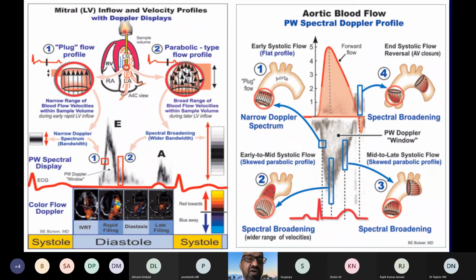So they are all close to the mid-clavicular line. At the apex, you have put the probe, and you're trying to look at the velocity profile across the mitral valve. Because the blood flow is coming from the left atrium into the left ventricle, in transthoracic echocardiography using this apical 4-chamber view, blood is coming from left atrium to the left ventricle during diastole.